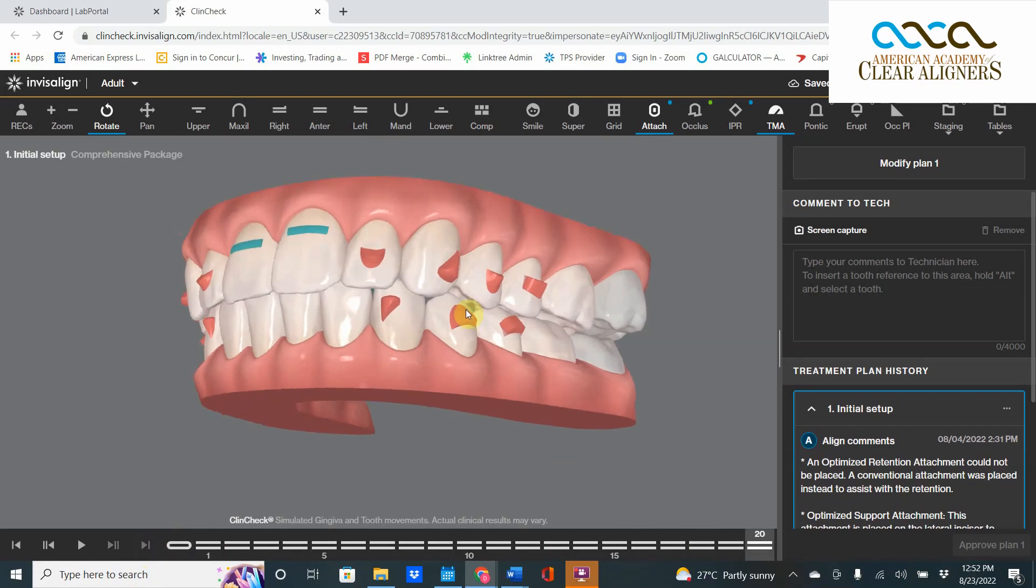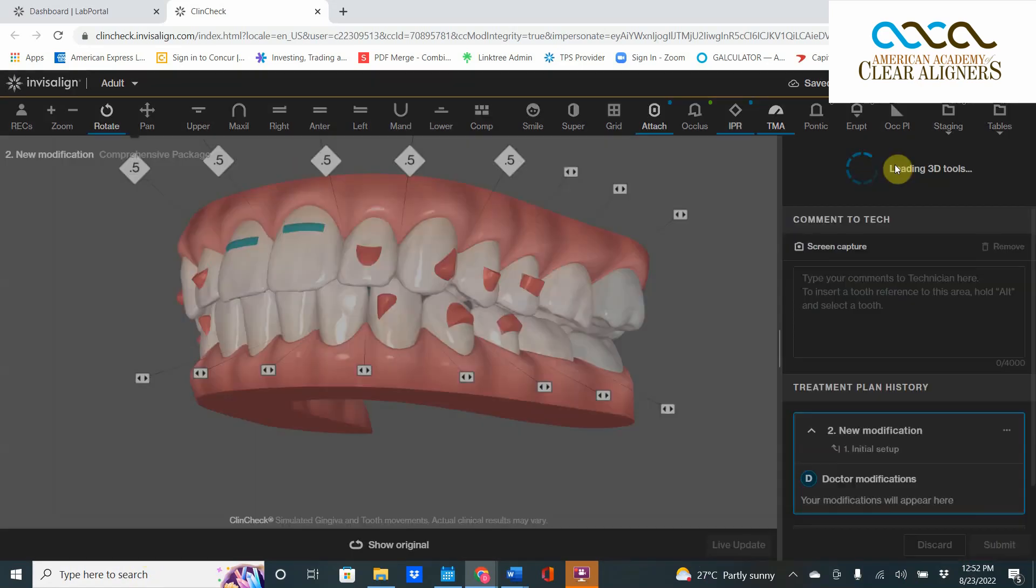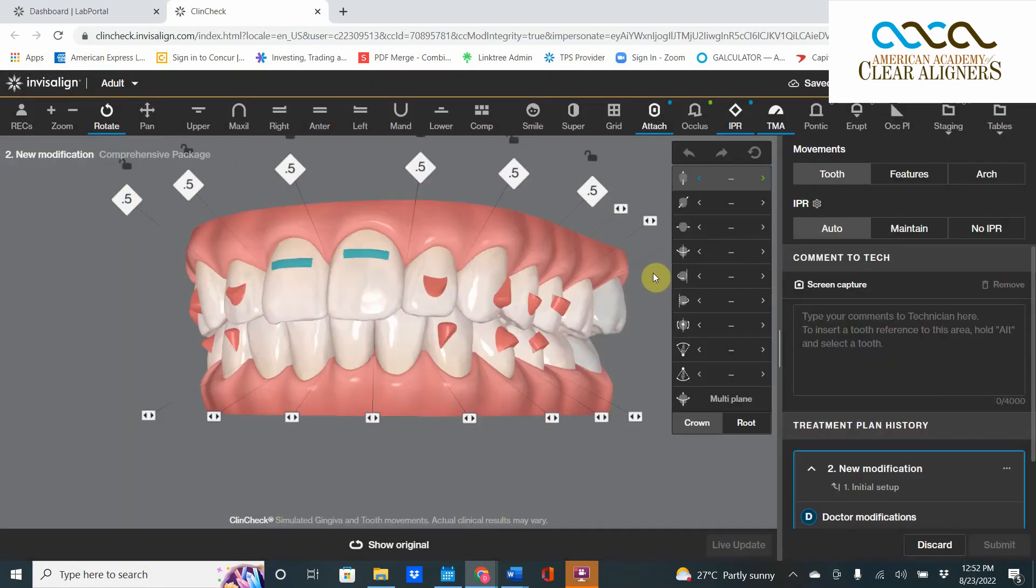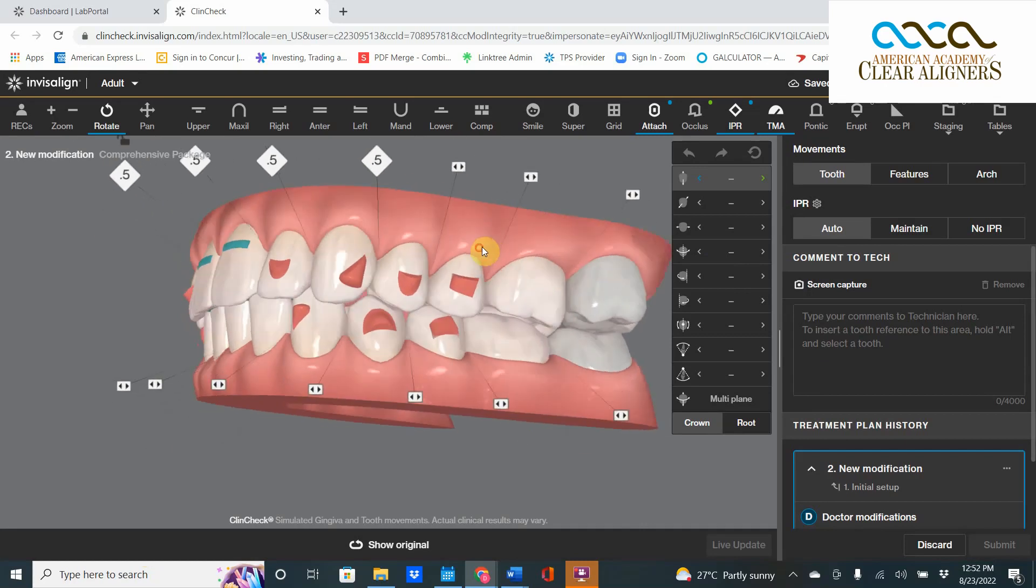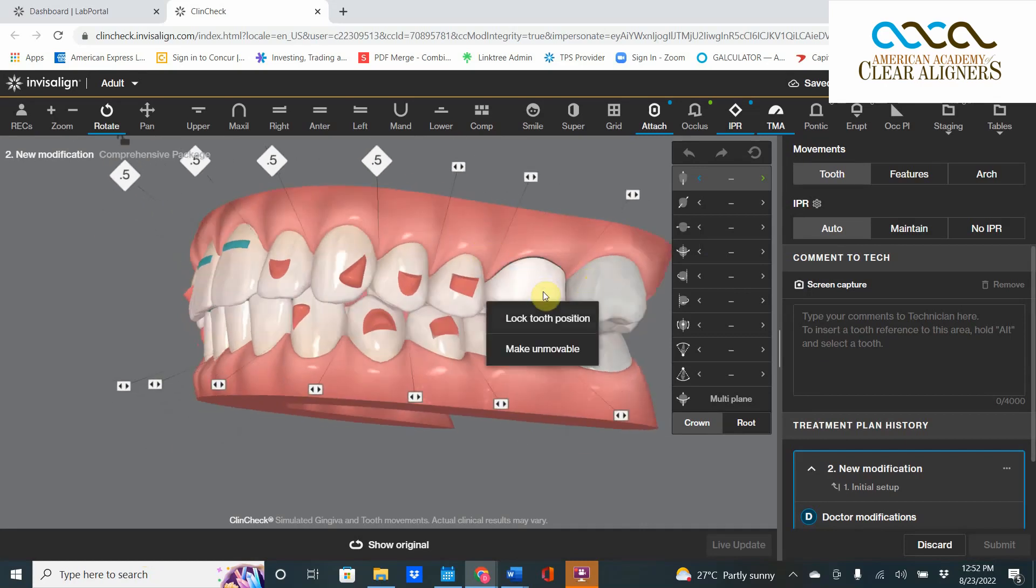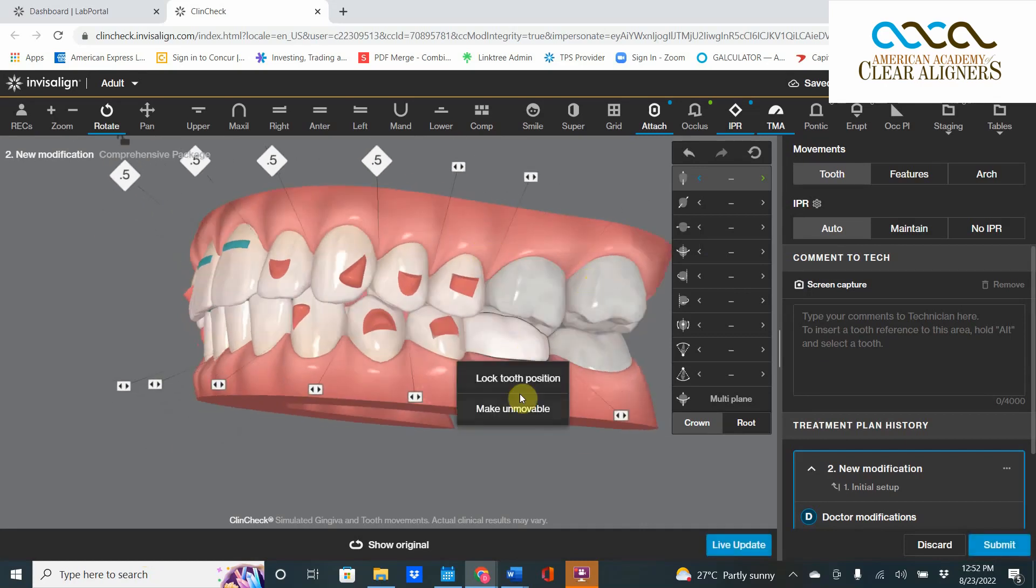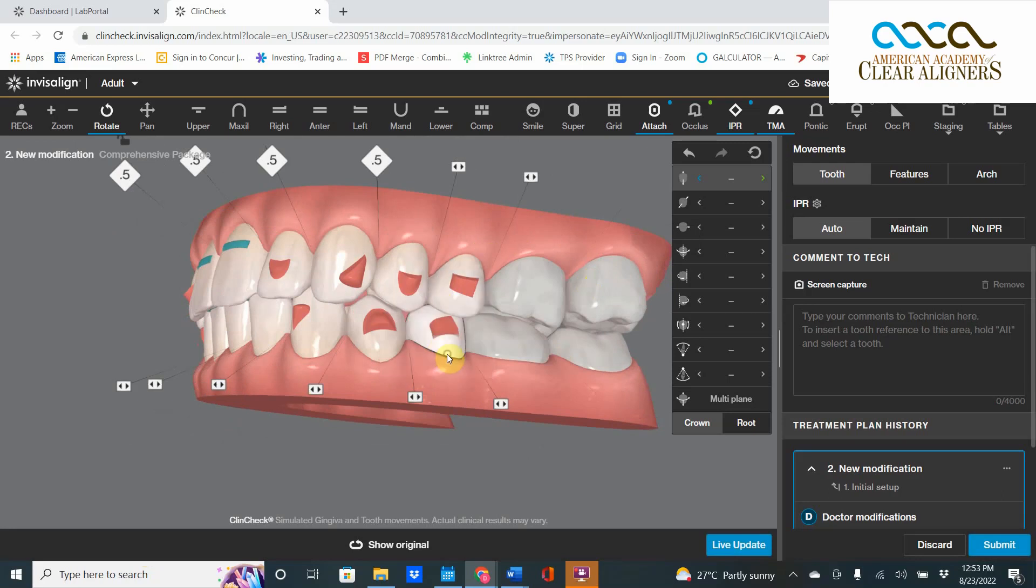So what do we do? We go into Modify Plan number one. And in Modify Plan number one, the first thing we want to do is we want to make these teeth unmovable. Boom.